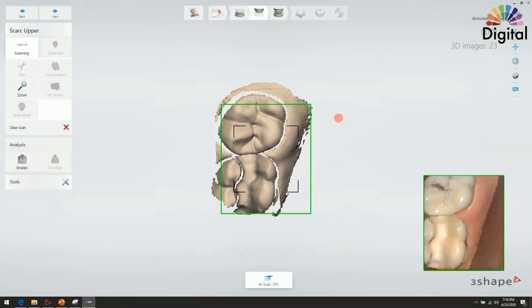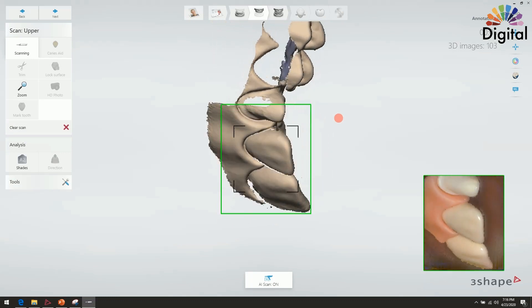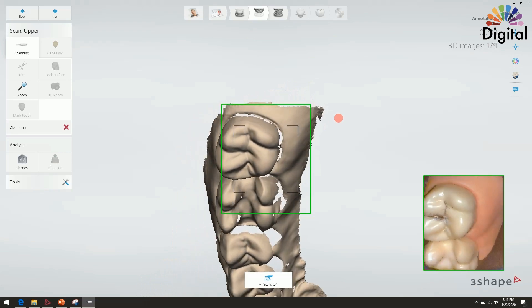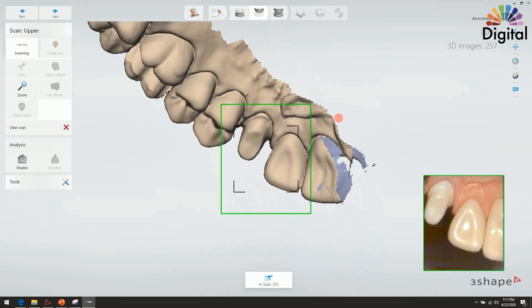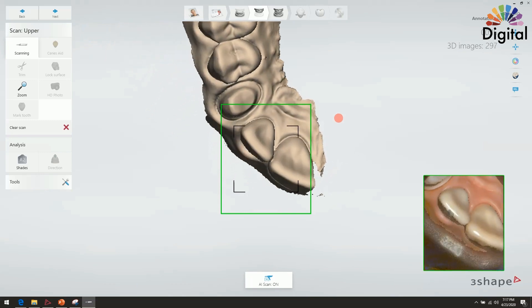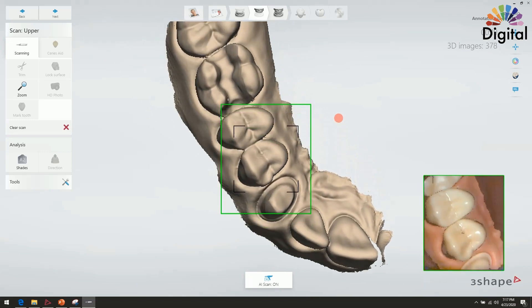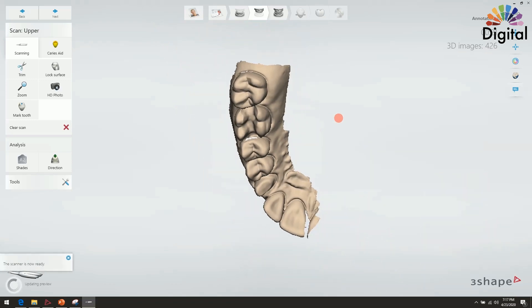I'm scanning a typodont to myself with the TRIOS here, scanning with just non-color mode because I want to show you guys about the details. Even with the TRIOS, even if we scan in non-color, after the scan is all done — when you do the design or after the scan is done — we can switch to color anytime. I'm just spending about 20 seconds to get the initial scan here.